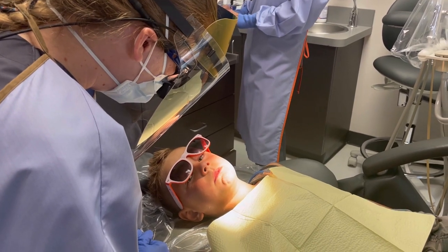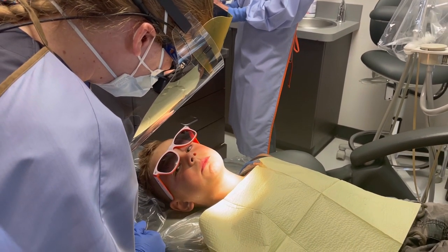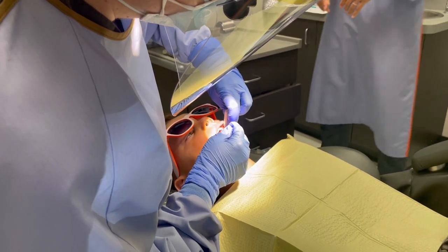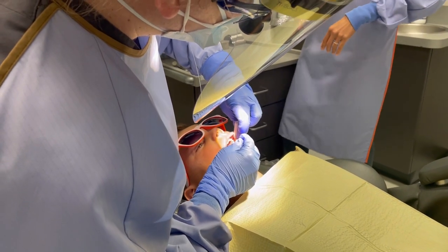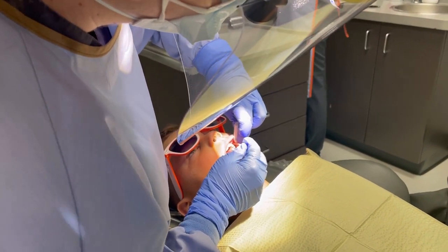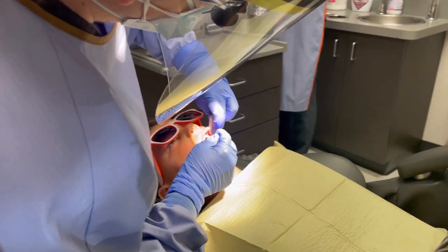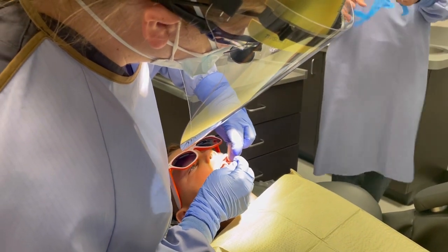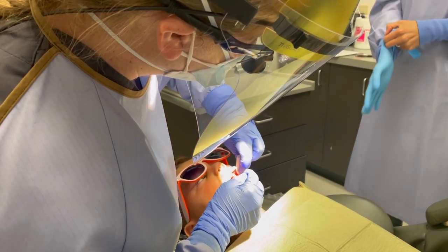Are you okay if we took care of that today to make that tooth feel better for you? Yeah. Okay! Sometimes it feels a little weird because it kind of starts to tingle a little bit, and that's normal — kind of like what I was talking about before, where your foot falls asleep. That's a different feeling, but that's what we want it to start to feel like, because we want that tooth to take a nice little nap for us.